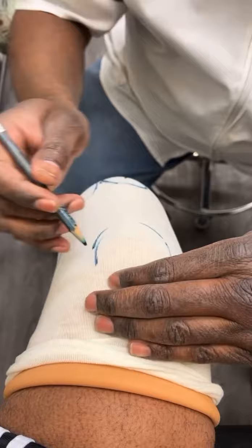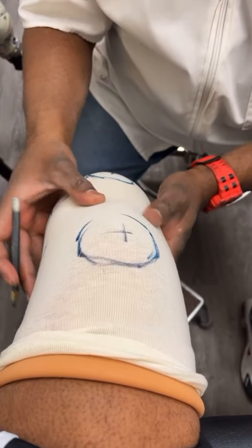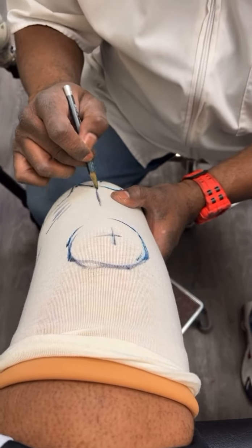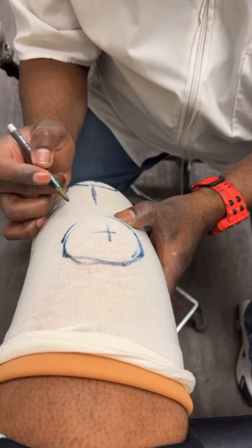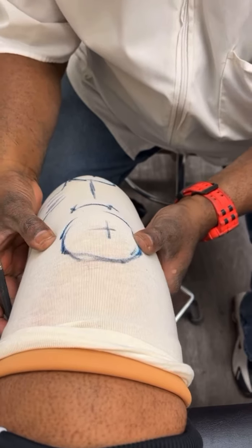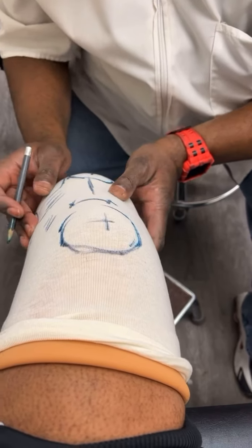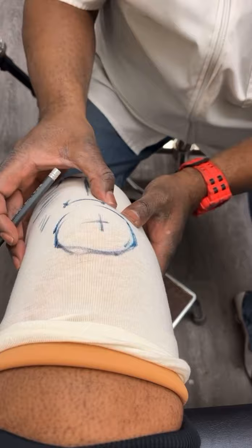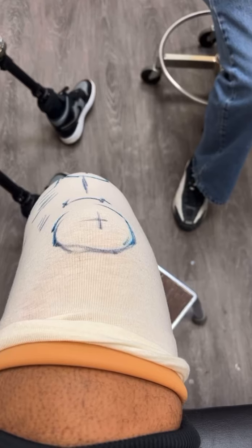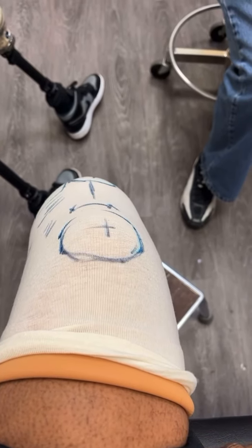I've had a few different sizes because right after the surgery you have the swelling, so they're one size. But this practitioner right here — I love him from the first time I spoke to him because of some things he told me, like how generic the make of the socket was. You can tell because there was so much space. These socks that I have to put on it, we call them plies — like five ply, three ply. You're supposed to put on a maximum of maybe a two ply to go throughout your day. I think I have a total of about 13 — I have two fives and a three on each side. So that's like a whole other socket. It's crazy.